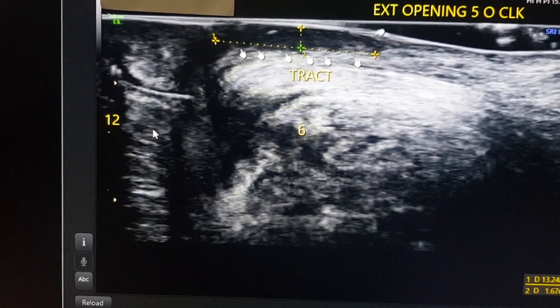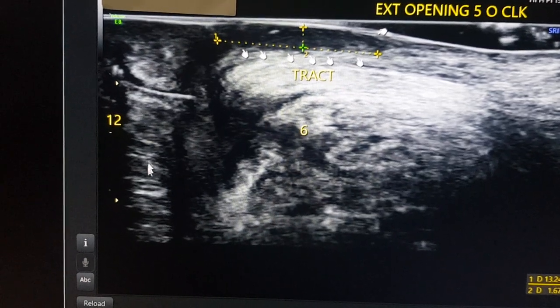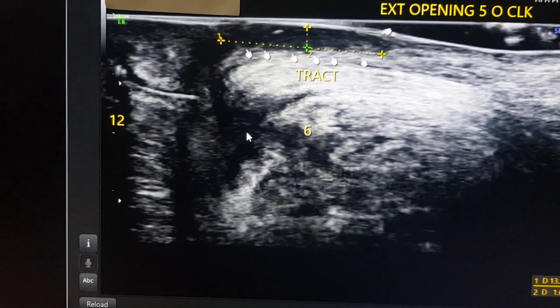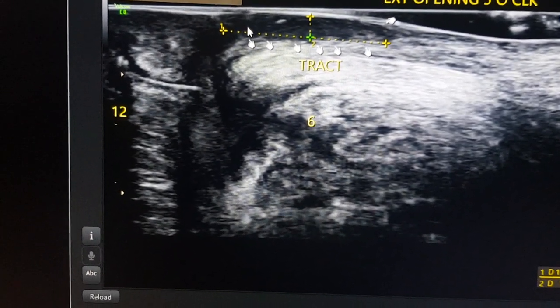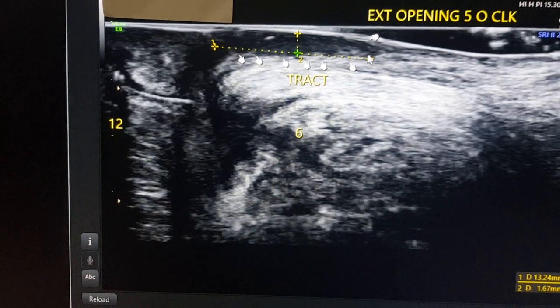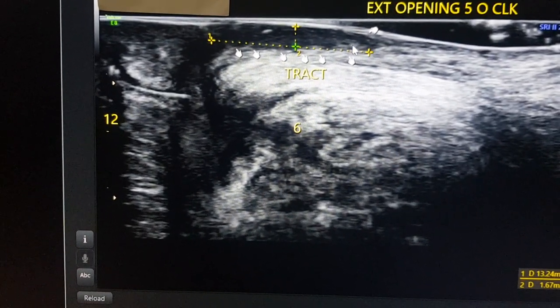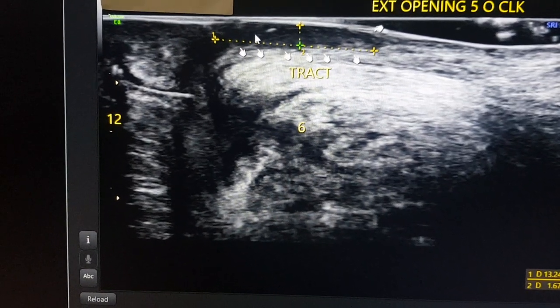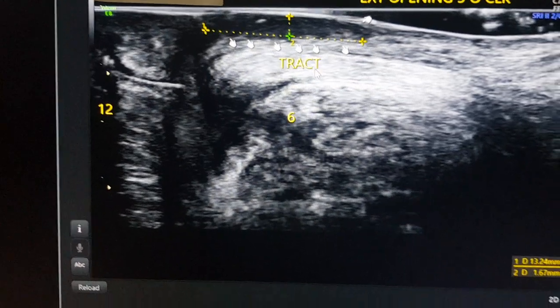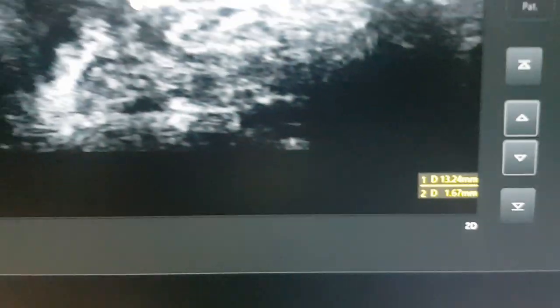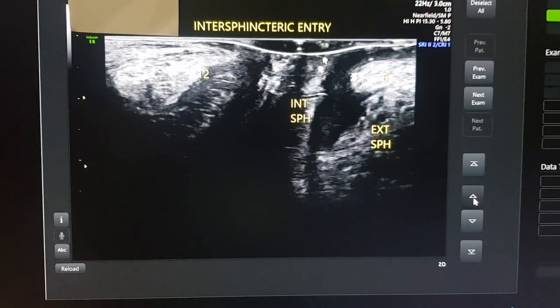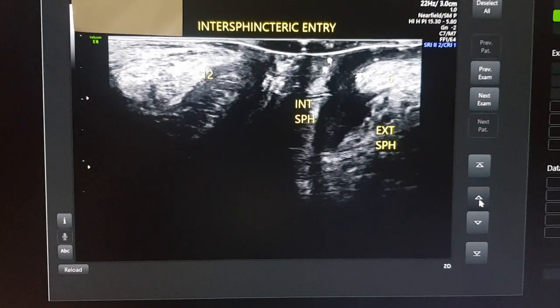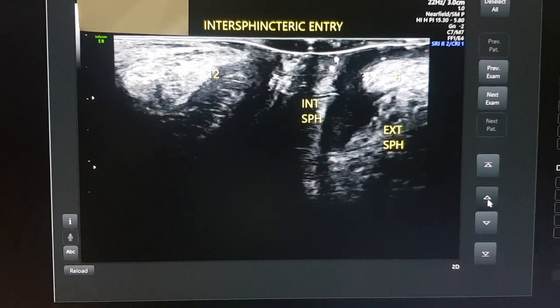This is the anal canal. You can see the internal sphincter muscle fibers. What I do first is measure the length of the tract. First, mention the external opening location, then talk about the direction of the tract and the plane of the tract, then measure the length of the tract — it is 13 mm long and 1.6 mm in width. That is the first point we arrive at.